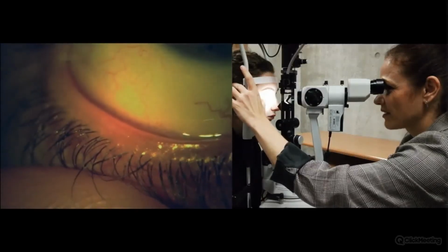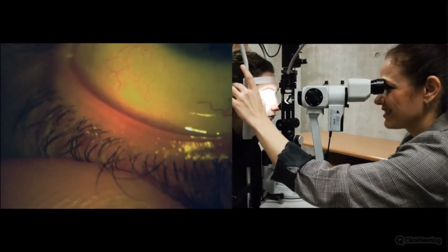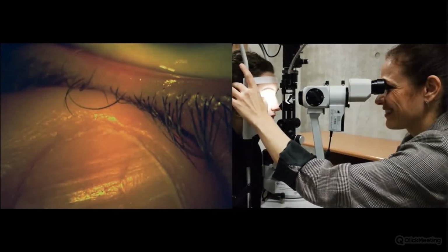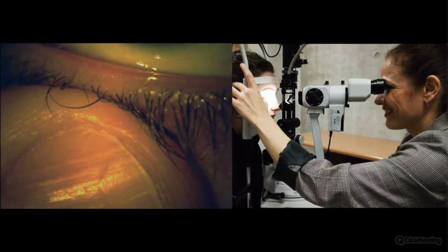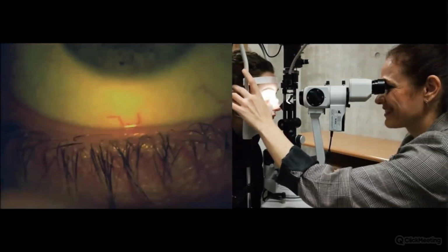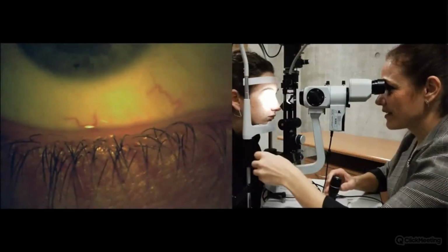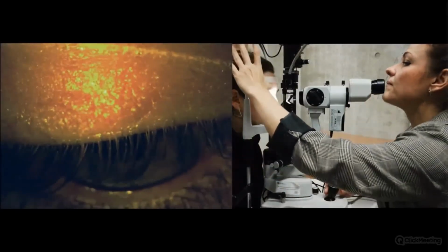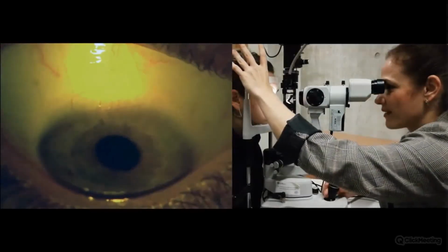here there is a visualization of the Meibomian glands, and just now I push, and here you need to see the meibum that comes out from the Meibomian glands.